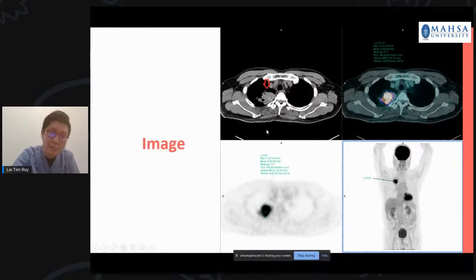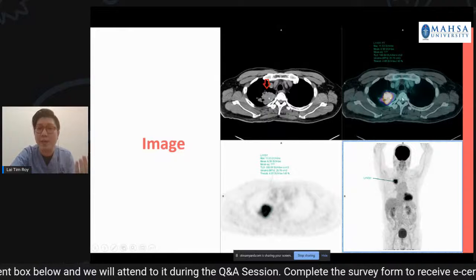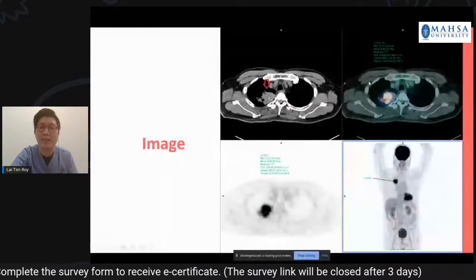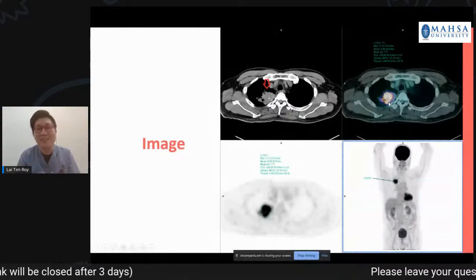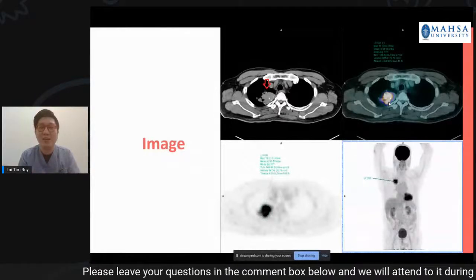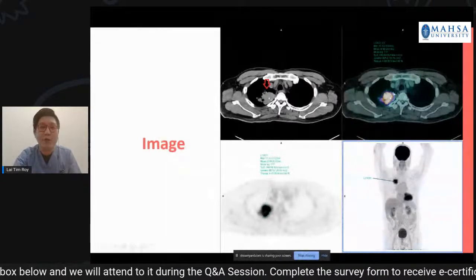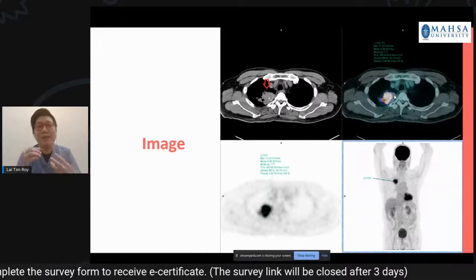This is a CT scan image, which is the axial view. And this is the axial view of the PET images here. And this is the fusion image. A fusion image is a combination of CT and PET images. The color here we can manipulate in the system in our post-processing, so the color is just an indication. It's not that every PET CT image will produce color as such; that's a setting where you can select certain colors.